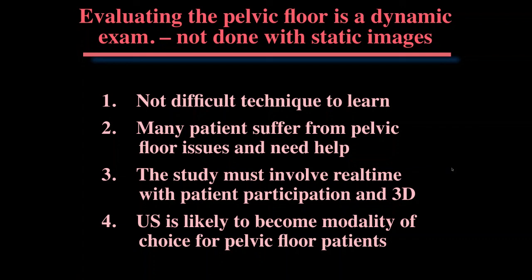The transvaginal probe has a sheath on it, a condom, and then you go through a disinfection process where you put it in Cidex or you do whatever is involved in your organization. I wouldn't know what to do with a 3D probe in order to provide proper disinfection. So I know some people use it.